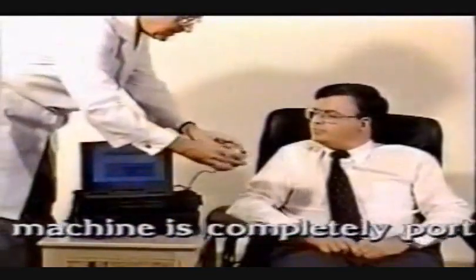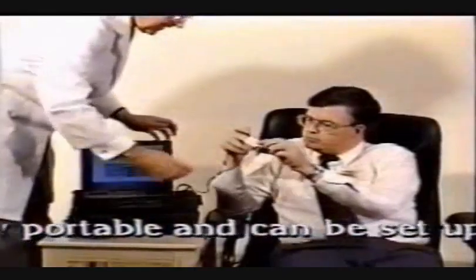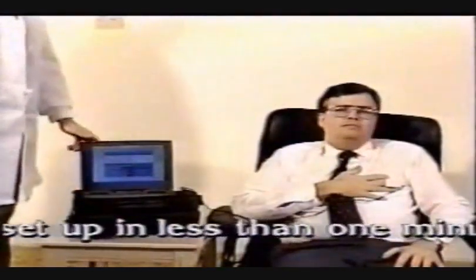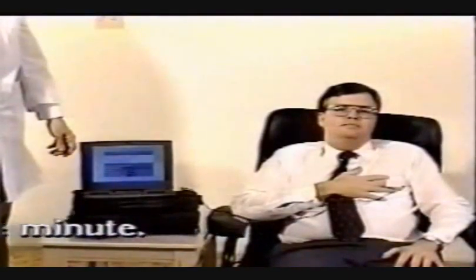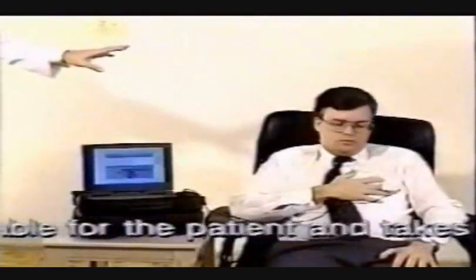Could you slip this over the middle finger of your right hand? Okay. And hold it at heart level. That's good. Now, if you just close your eyes, relax, and keep your hand over your heart, this will take only a minute or two.